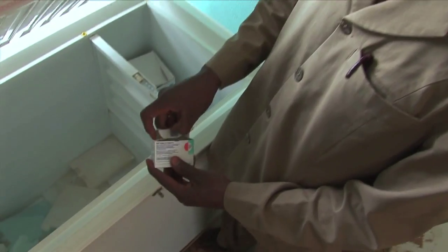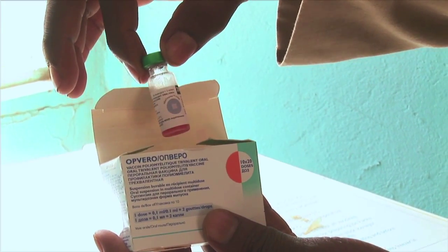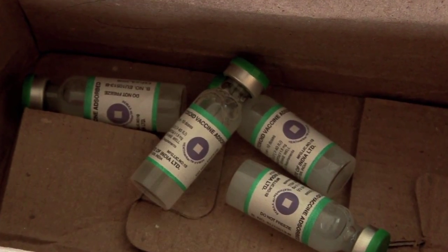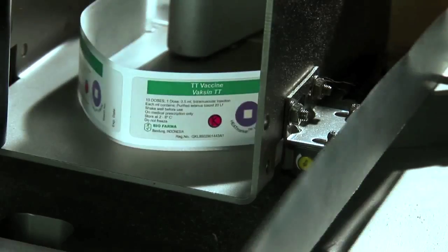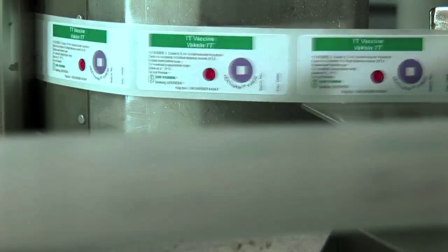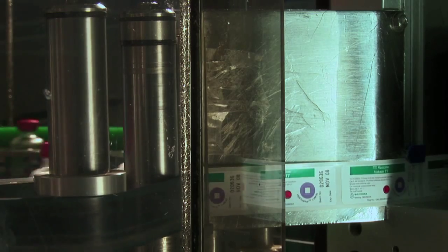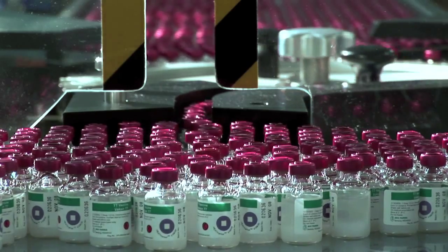It indicates to health workers whether the cumulative heat history of the product has exceeded a preset limit. The VVM is a label placed on the vial. You can easily recognize it.